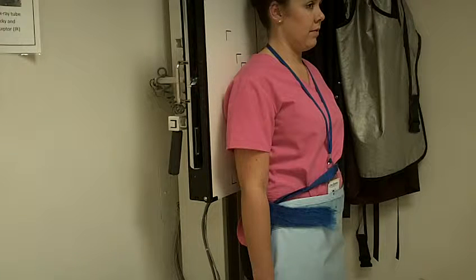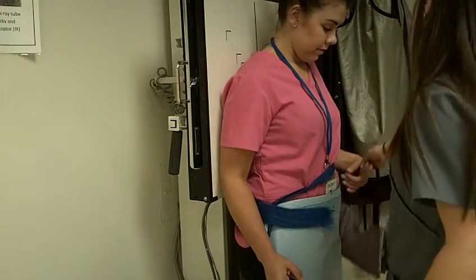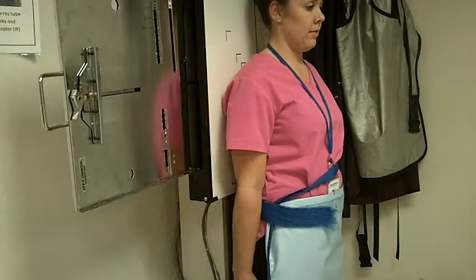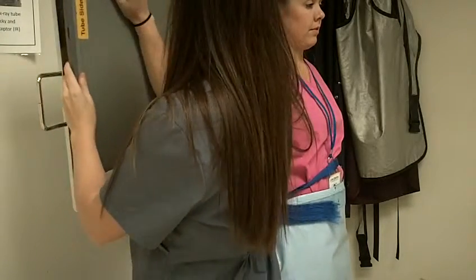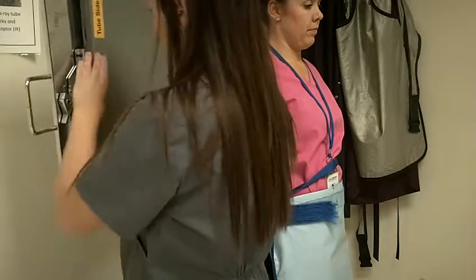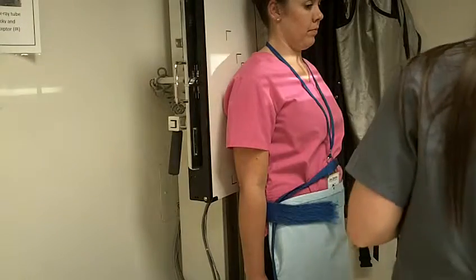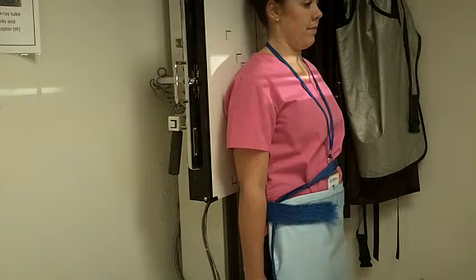For this one, all I need to have you do is just hold one of these in each of your hands. And I'll put a mark around here for that. I'm going to go ahead and go behind the booth and take your image. Ready? Click.